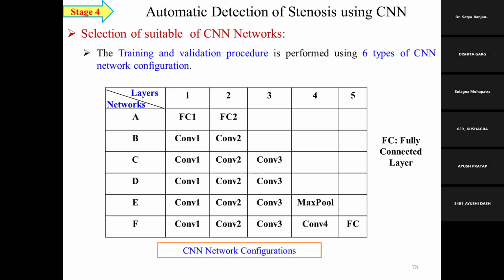We don't know, we are also a black box. I told you to take VGG 16. You might ask why VGG 16, why not EfficientNet, why not ResNet 50? And if VGG 16, why should I consider all 5 blocks? If within 4 blocks I get better accuracy, then why have the extra block? It will take computational resources and time, and the time complexity is also very high.